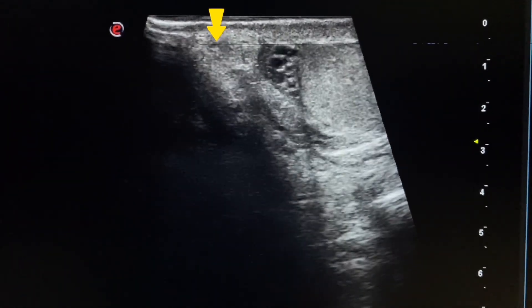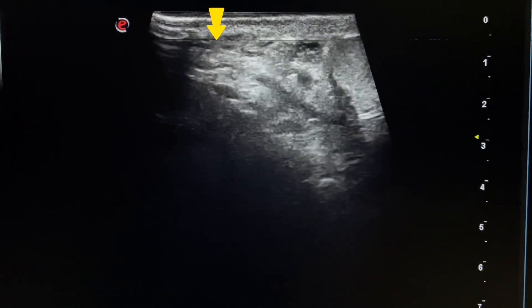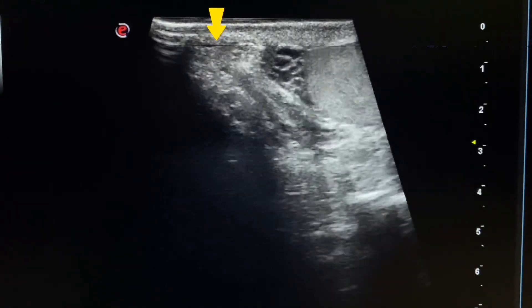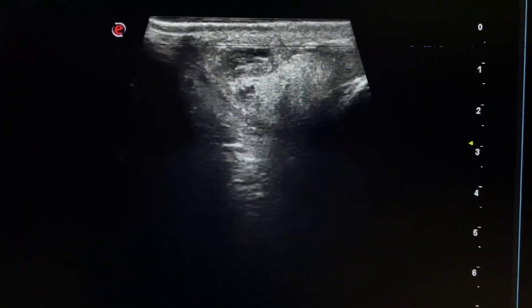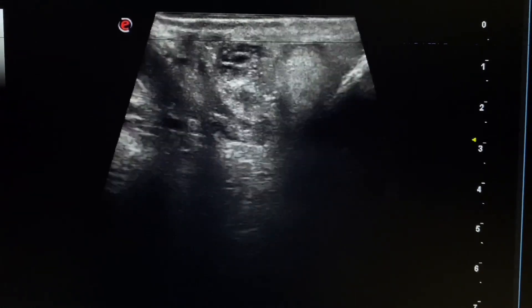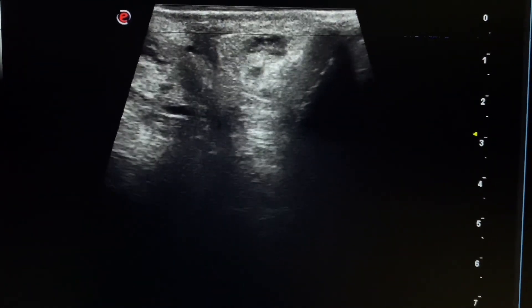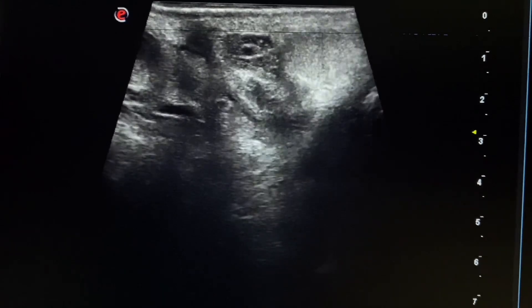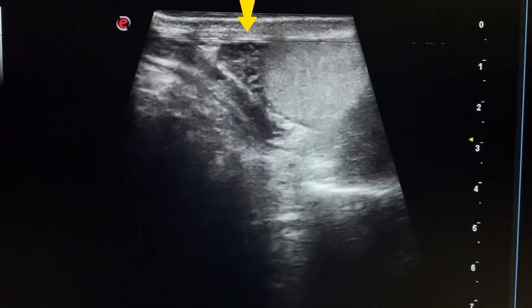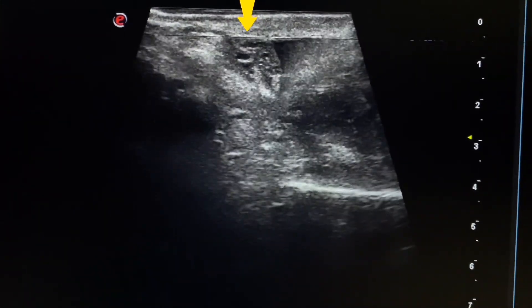This is the proximal part of the spermatic cord, which is also mildly inflamed and echogenic. The epididymis shows cystic structures.